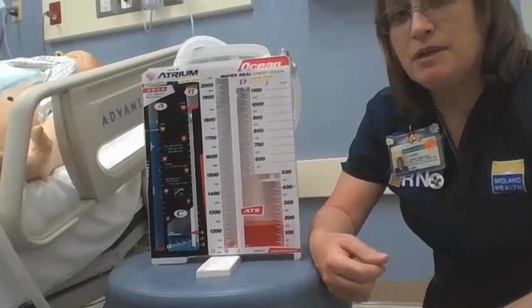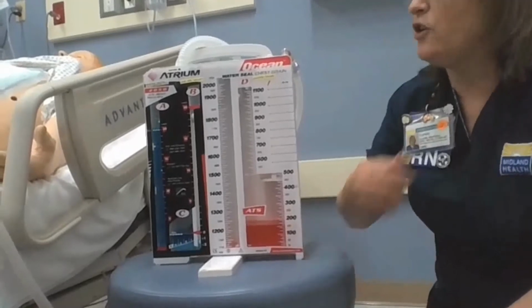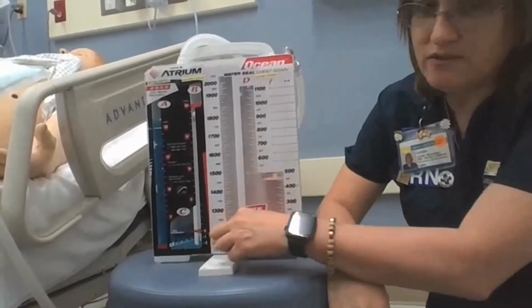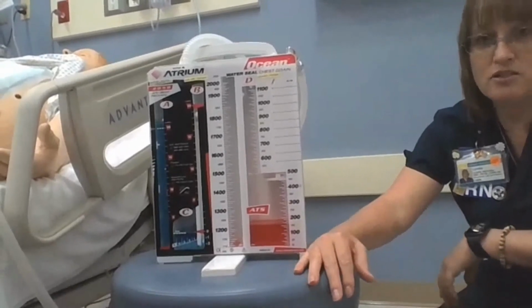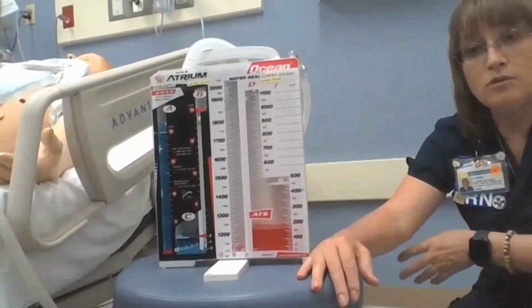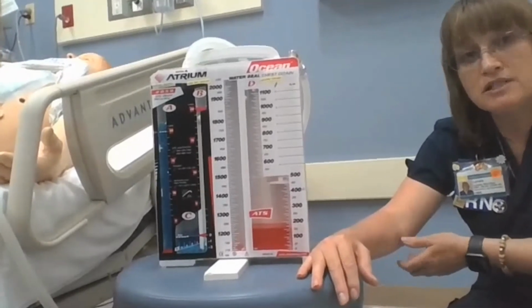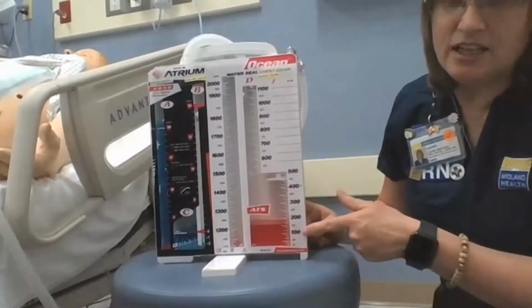If you have continuous bubbling in chamber C, that tells us that we have an air leak. And that's why we go and check: do I have subcutaneous emphysema? Is my connection taped? Is my atrium cracked at all? So I'm looking to see what is the cause of this continuous bubbling. Now, if you have a huge pneumothorax, a bunch of air in the chest, you can occasionally get bubbling when the patient exhales. This is not what we normally see. What we tell everybody is there should never be any bubbling in chamber C. And if there is, you need to go find somebody who is more experienced than you to help solve the problem.